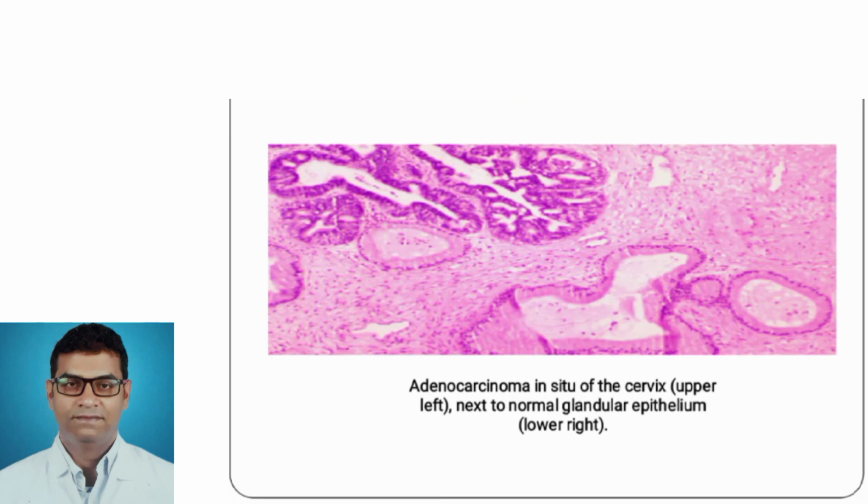Glandular cells. Adenocarcinoma in situ of the cervix, upper portion, left side, and there is normal glandular epithelium that is seen in the picture, lower right side.